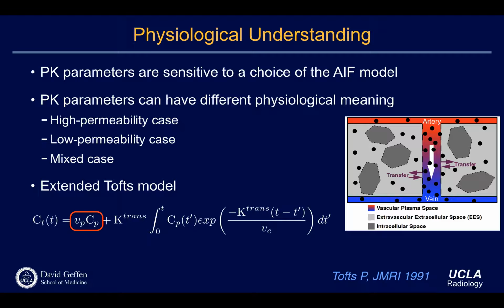I have a question. Sure. So what's the relationship between perfusion and flow? Similar questions. I think that's a good question. I mean, in this context, you can actually say flow is the same as perfusion. But again, it depends on how you define perfusion. I think things would be tricky. Particularly in DCE-MRI, you have to be very careful.